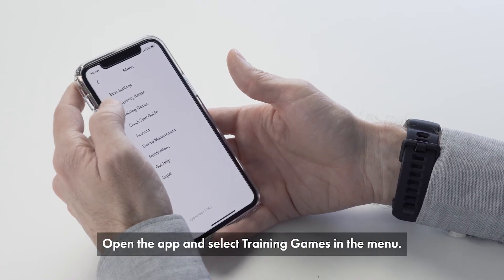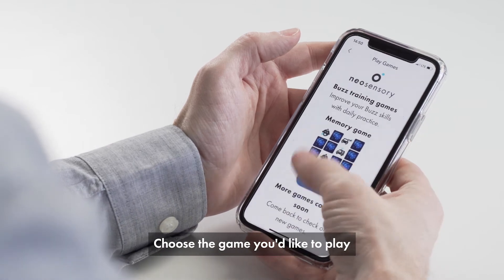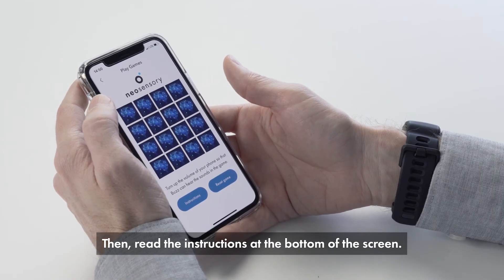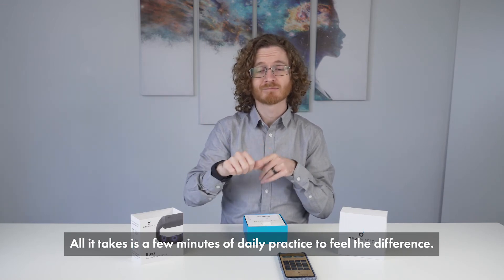Open the app and select training games in the menu. Choose the game you'd like to play, then read the instructions at the bottom of the screen. All it takes is a few minutes of daily practice to feel the difference.